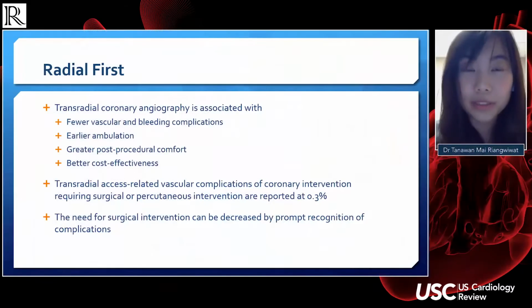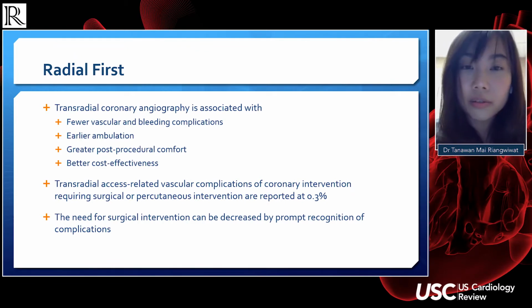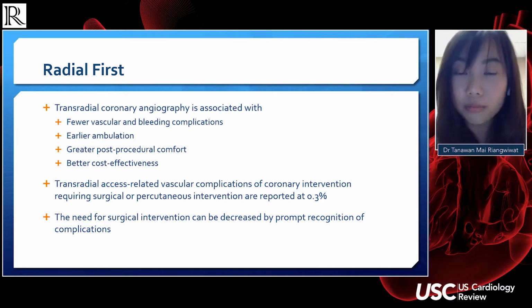Hi, good morning. Our paper is about radial artery complications, but first of all, I would like to talk a little bit about radial access. We are in the radial-first access era, because radial artery access has been associated with lower vascular complications and lower bleeding complications, earlier ambulation, better post-procedural comfort, and better cost effectiveness.